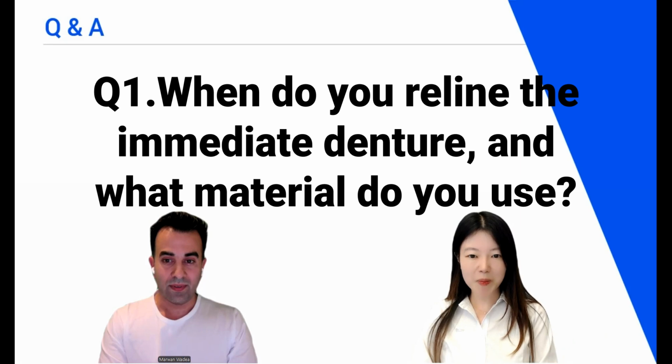So let's move on to the Q&A session. You can tell us more about it. Okay, question number 1. When do you reline the immediate denture and what material do you use?